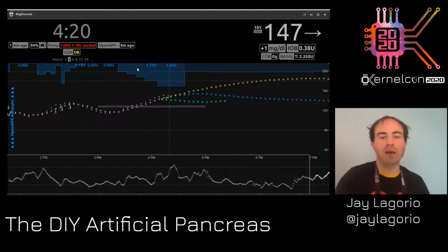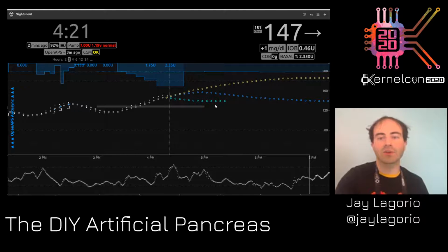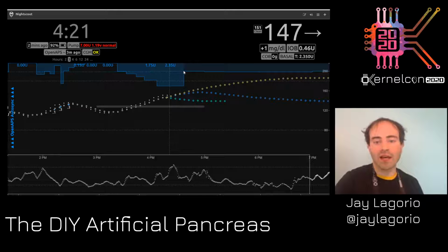And if you look up here at the top in this icicle pattern, this is using less insulin in background, and this is using more. It is taking a lighter touch than normal. Instead of using these larger boluses, it's trying to lower or even out my blood sugar using just the background insulin. And these are various predictions for what that is going to look like at certain times. I think it's 2 or 3 hours of prediction, depending on which one and what the rest of your system looks like. And so if I turn all of this off now, it looks like maybe 15 or 20 minutes, the pump is going to revert to its standard dumb, unthinking behavior.